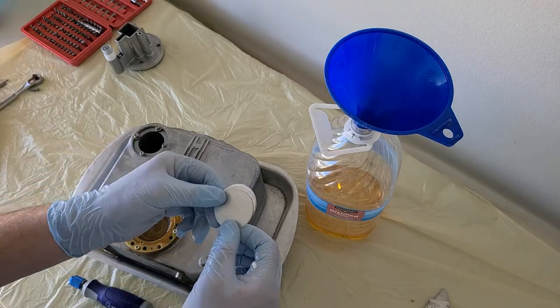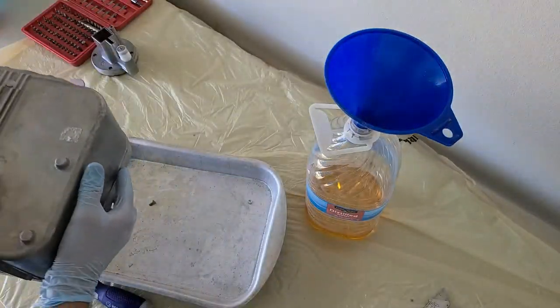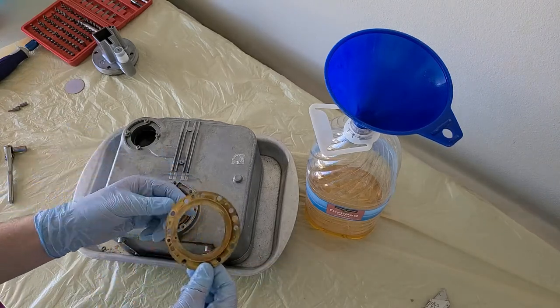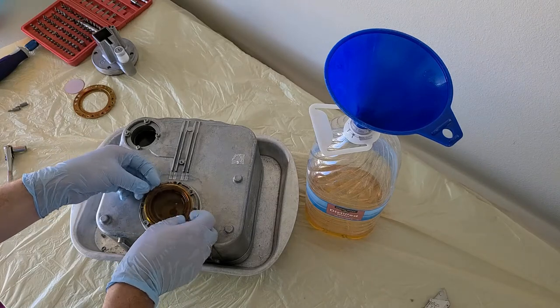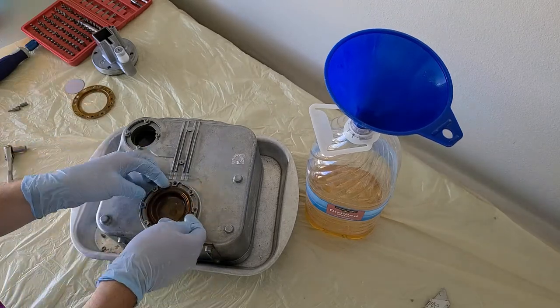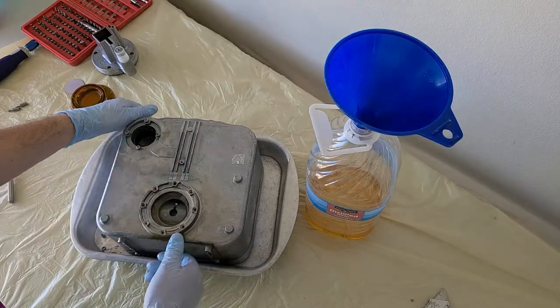Alright, here's some aluminum filtration, it looks like. And now the tube's right underneath this plastic cover, which I'm going to go ahead and take off now. Alright, so let's go ahead and remove the cover here. There you have it, a little plastic cover. You have the O-ring here, which makes the seal so the oil doesn't come out. And the tube is in here. You can see it in some kind of plastic sheath. So it's actually underneath. It's kind of hard to see here.